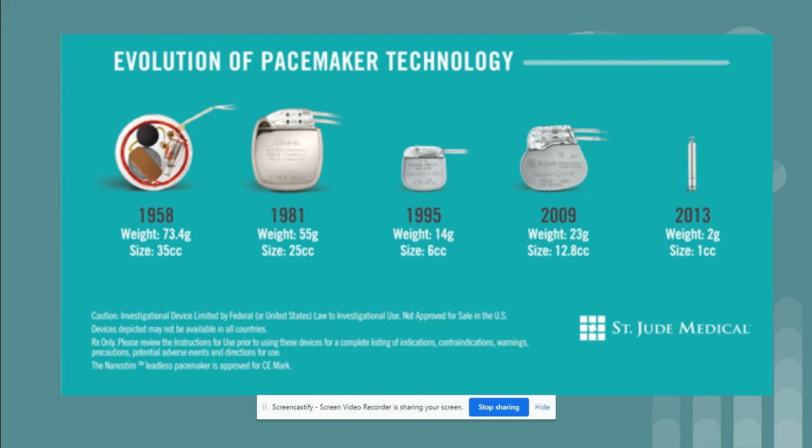All right, the evolution of pacemaker technology: in the 1950s, many of these were large, cumbersome apparatuses, and they had to be put in externally for short-term use. In the 80s, they came out with an implantable pacemaker, still quite a bit smaller, but as we move into the early 2000s, you can see that they have been a little bit bigger, but they also can do ventricular and atrial pacing. And more recently, a tiny implantable pacemaker, which you'll start to see more often as these wear out and people come in for replacements.